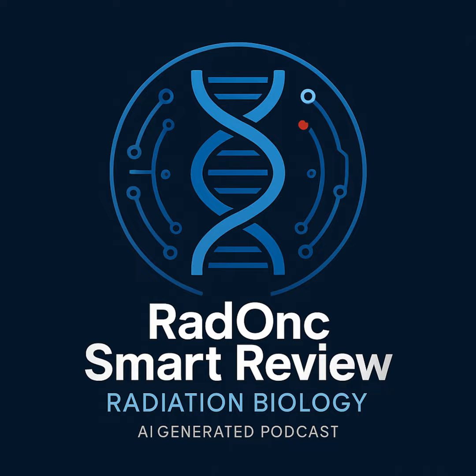Right. A positron, which is basically an anti-electron, positive charge, and also a neutrino, but we don't worry about the neutrino. Got it. Tiny positive anti-electron. What happens to it? It doesn't get very far. It travels maybe a few millimeters in the tissue, losing energy, and then inevitably it bumps into an electron. Matter meets antimatter. Annihilation. They completely destroy each other. Their mass gets converted entirely into energy. E equals mc squared. Wow. Total conversion.